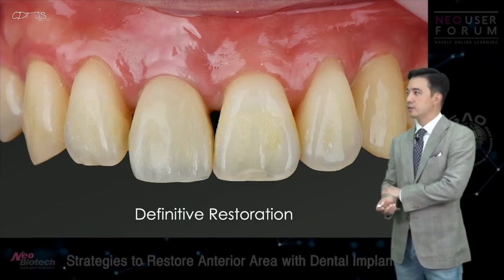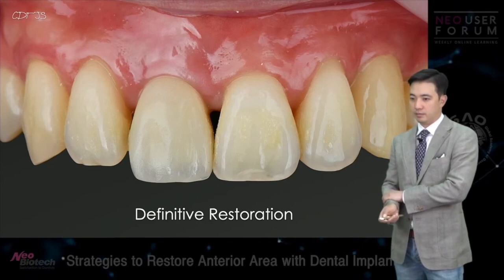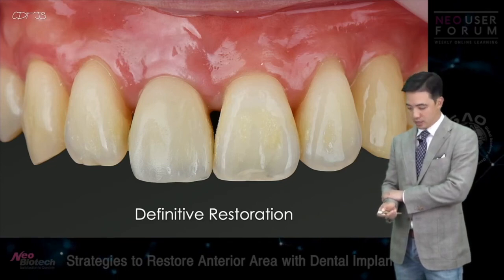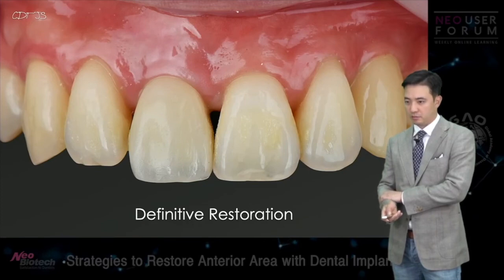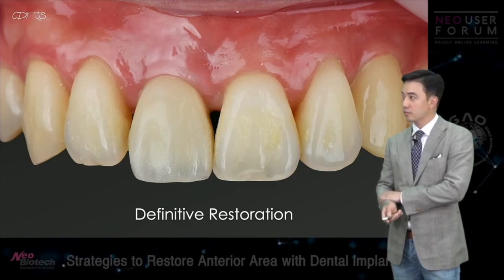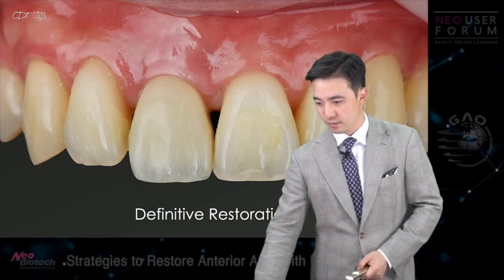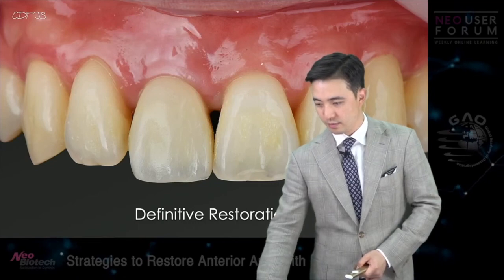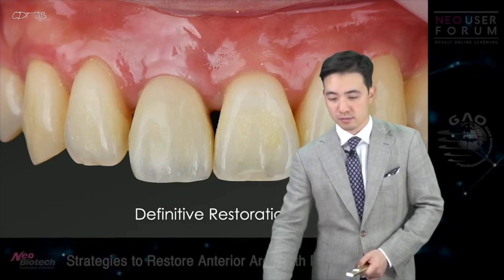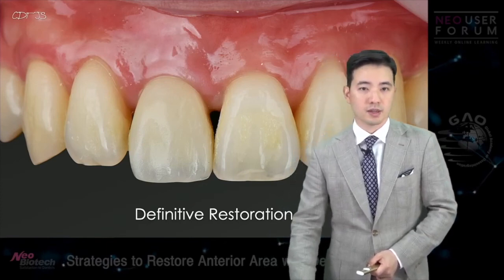Well, I did have a little bit of loss of papilla here, but not a big deal.